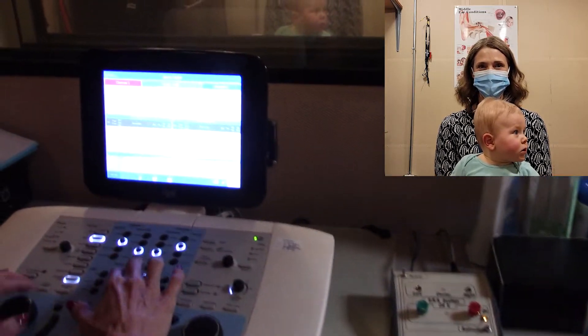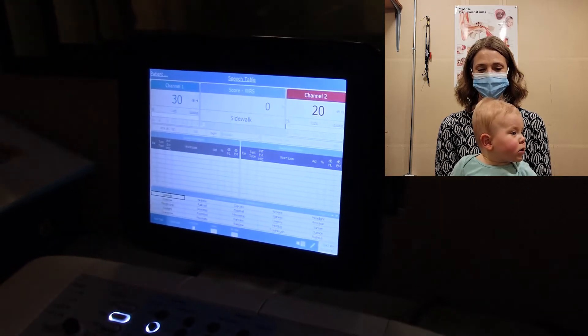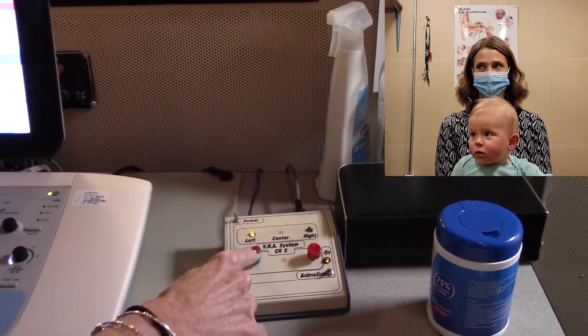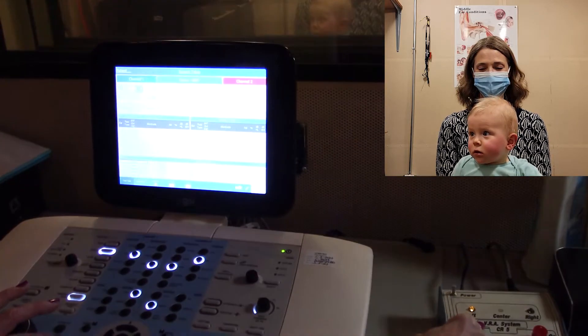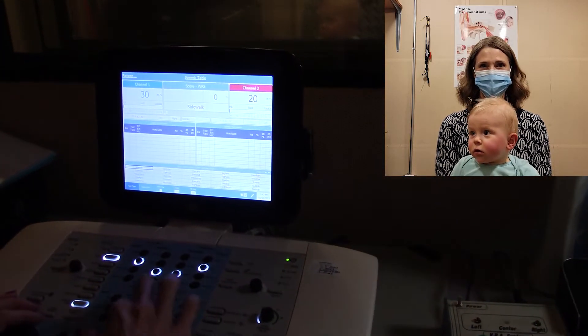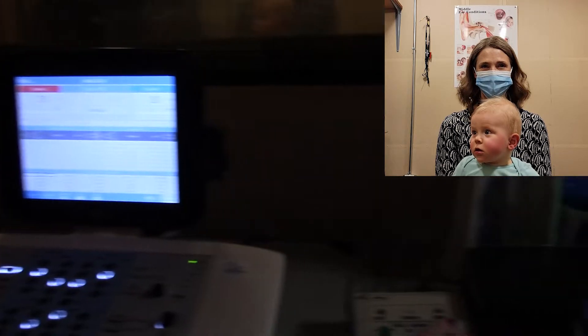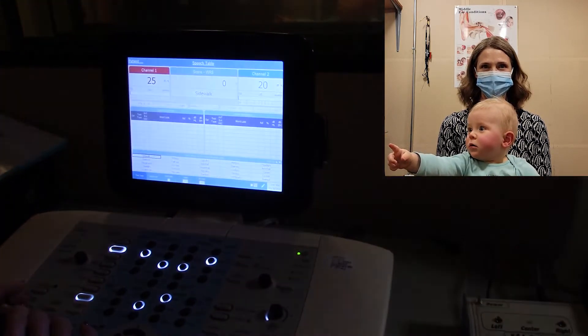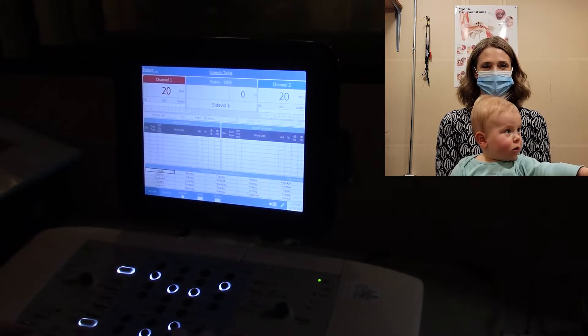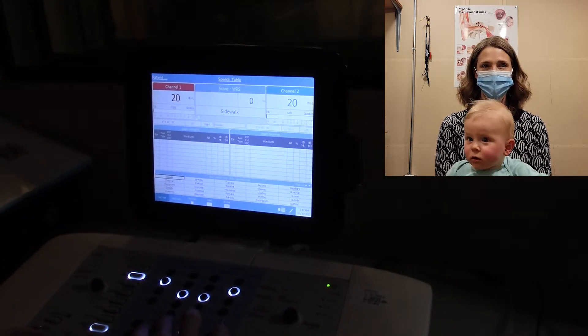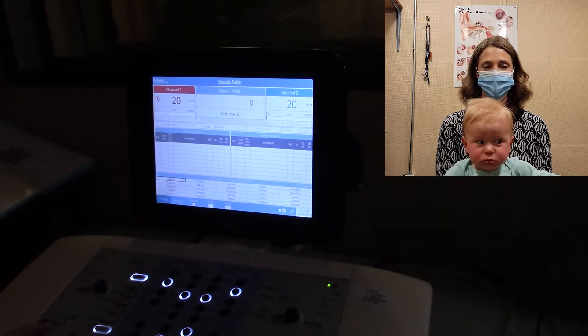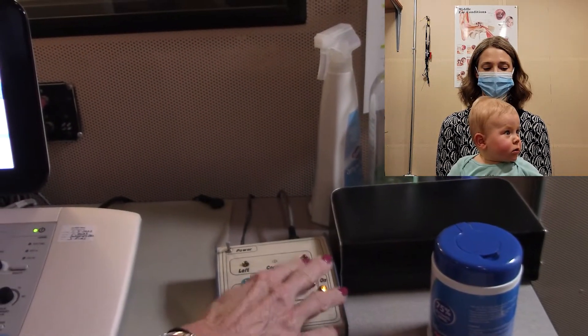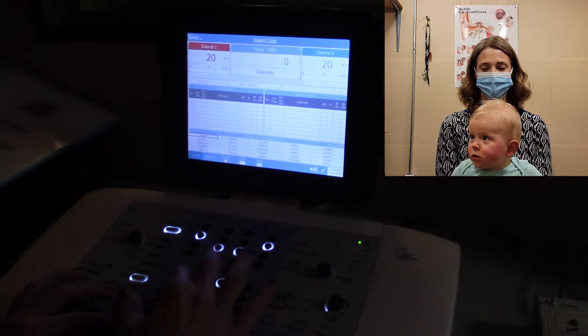Okay, now I'm going to switch to our left quickly. Hello there. And we're reinforcing that one. Very good. I'm going to go to our right and I'm going to drop to 20. He's going to... I think that was a response. We're going to get that again.